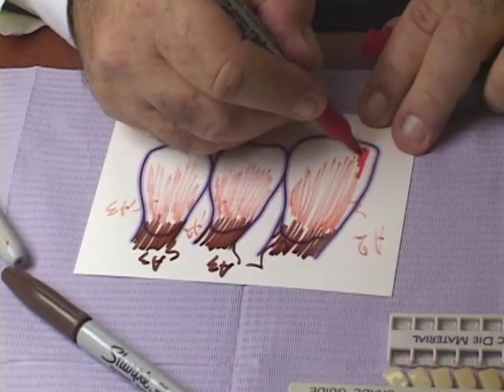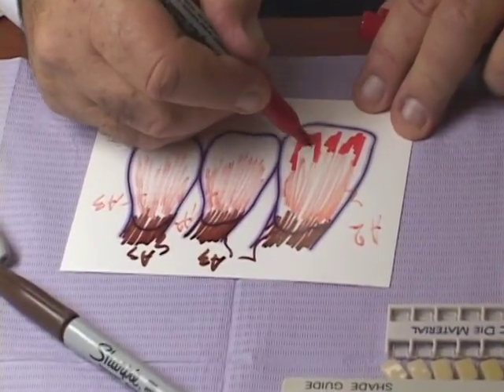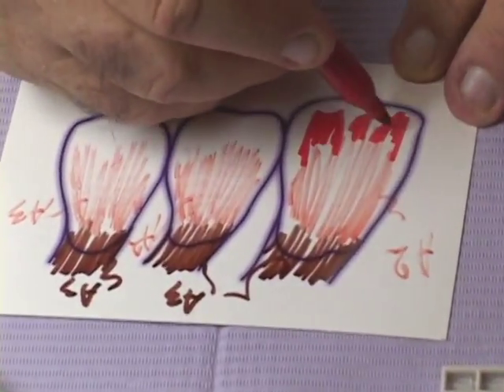The next part is to establish the dentin developmental lobes. What color is it? Normally it's a different color than the dentin. Most of the time it's a little bit darker rather than lighter. Centrals have 3 lobes, and we have to decide how far is it away from the incisal edge and how long it is.